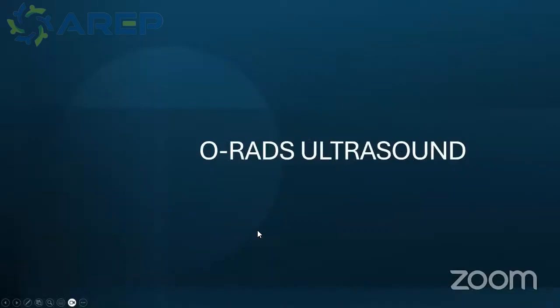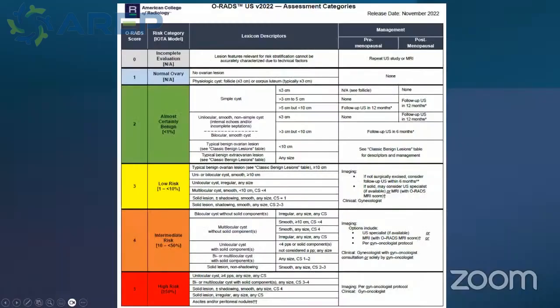So now coming to O-RADS ultrasound categories. So this is an ACR document published in 2022, the O-RADS ultrasound assessment categories. As we can see on the left side, there is a scoring system from 0 to 5. So we have 6 categories, and each category has an associated risk of malignancy and other descriptors, which we see here, and a management option for each of these categories, which is divided into pre and postmenopausal status.